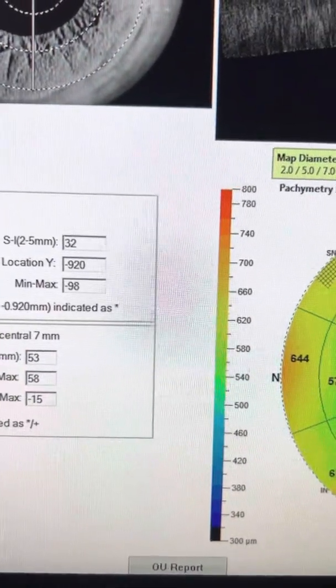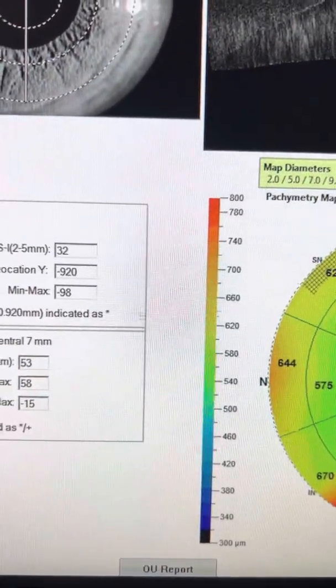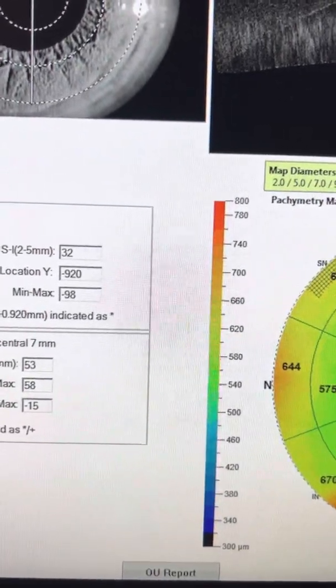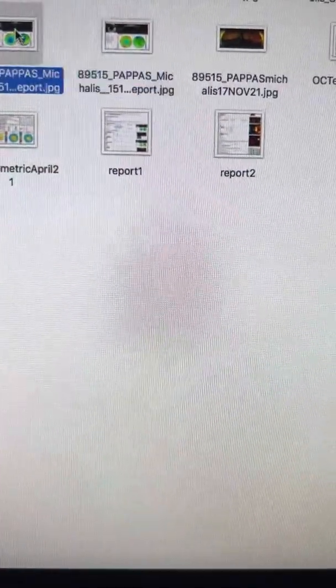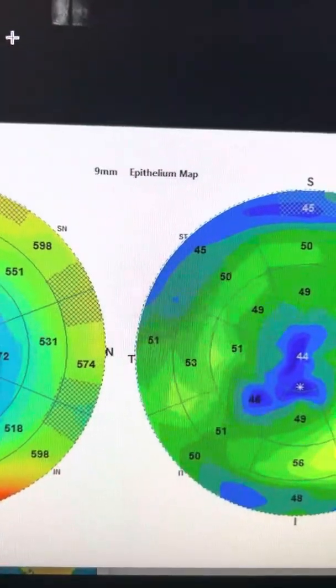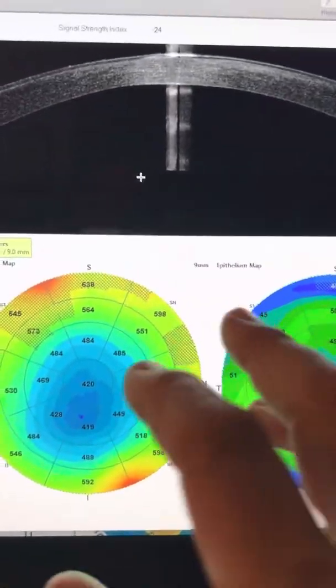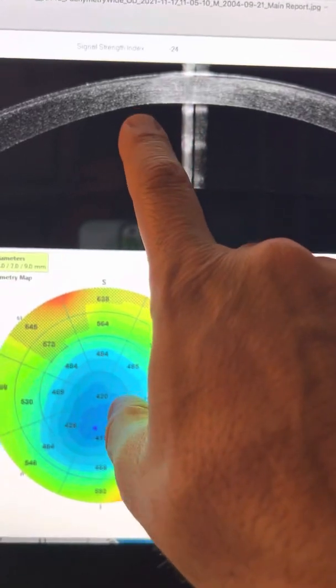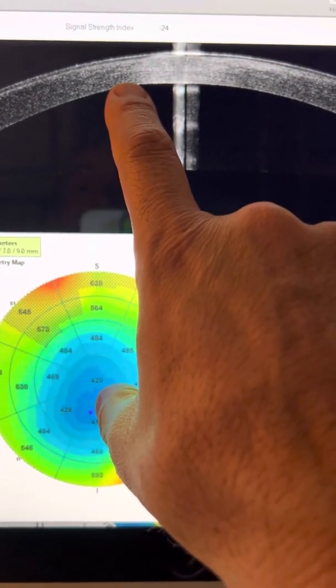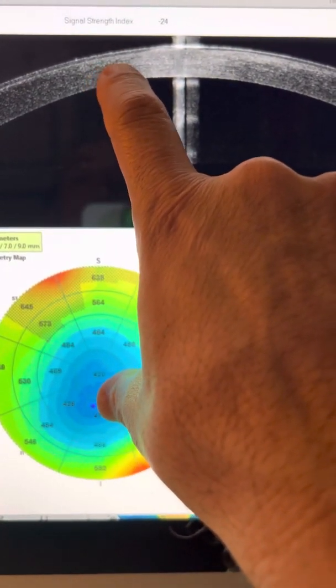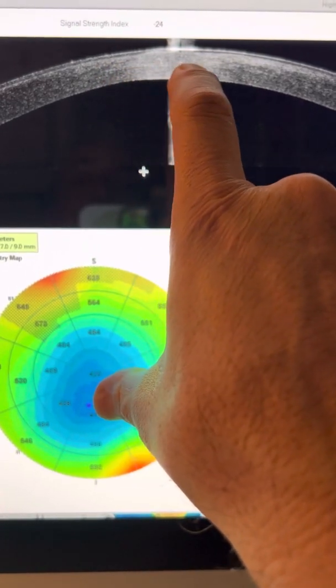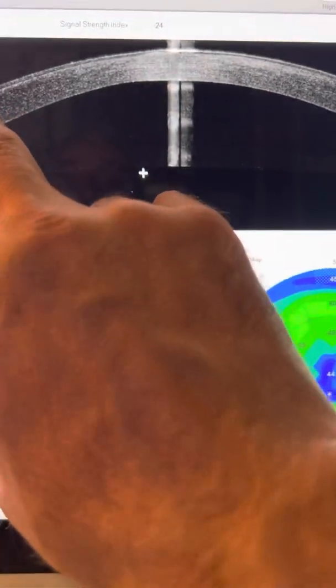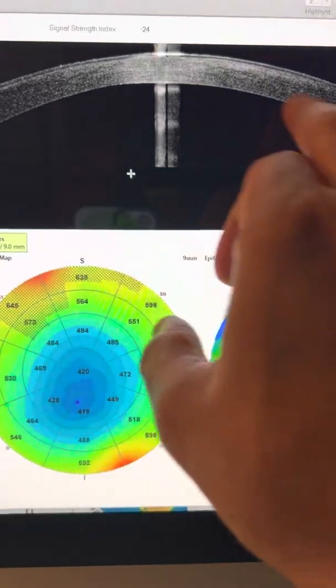So from the comparison on the anterior segment OCT maps, we saw that the laser treatment had taken place. We can kind of look at the cross-linking that took effect. It went down to about half the thickness, but there's no uniform CXL line throughout.